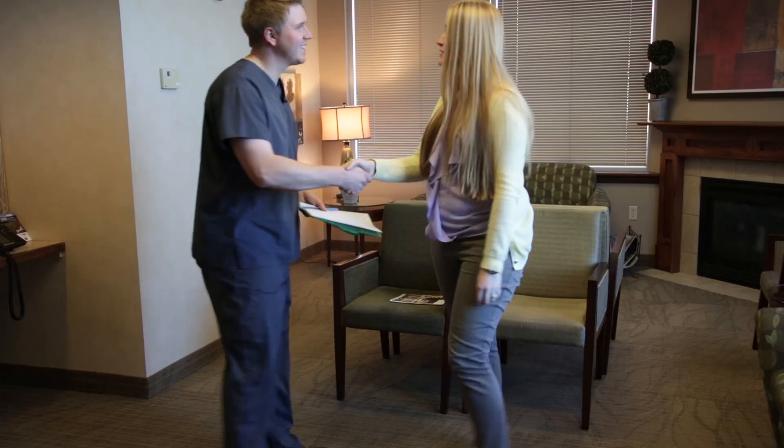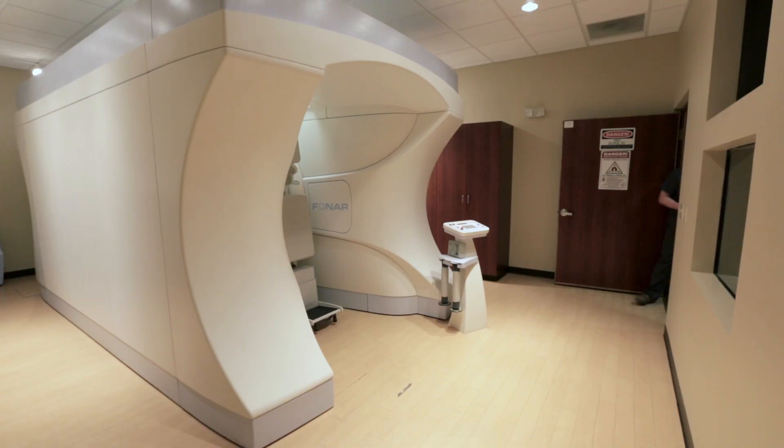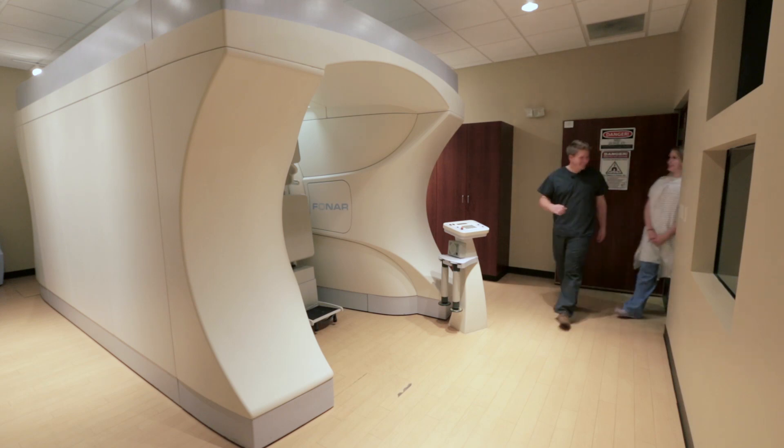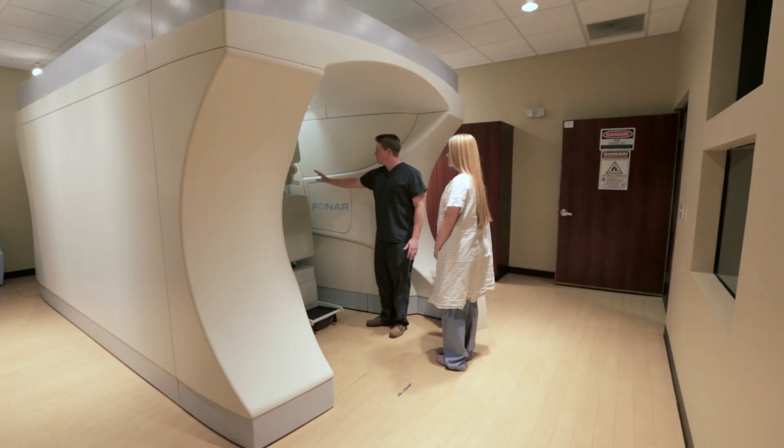The upright scanner is unique in that we don't have the patient laying down for all of the scans. It's built with two magnets that the patient goes between, instead of having the magnets surround them.